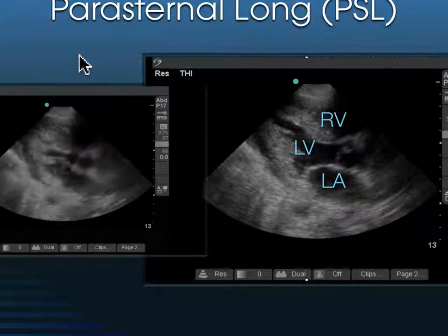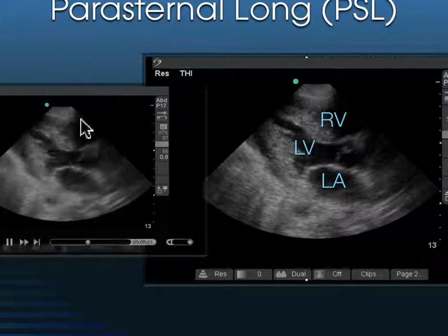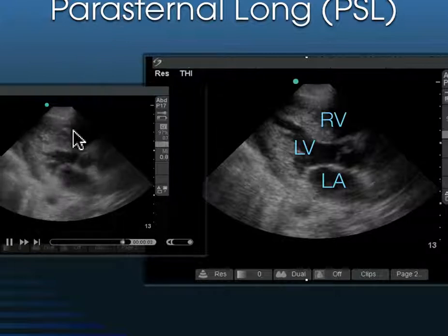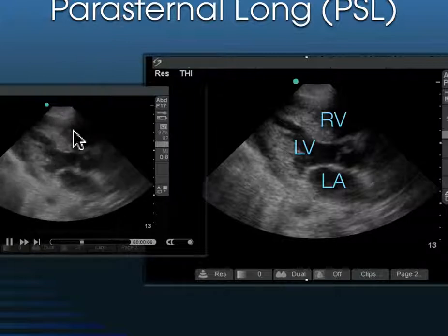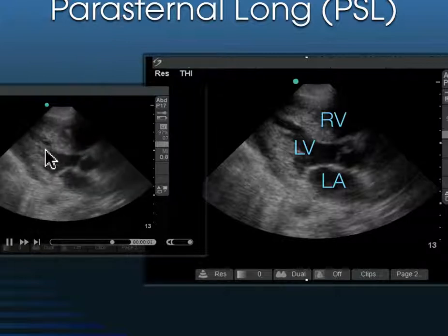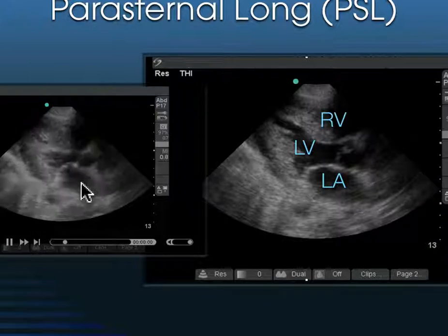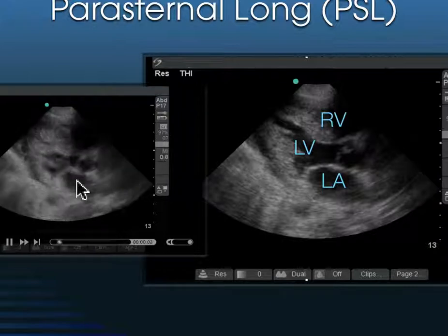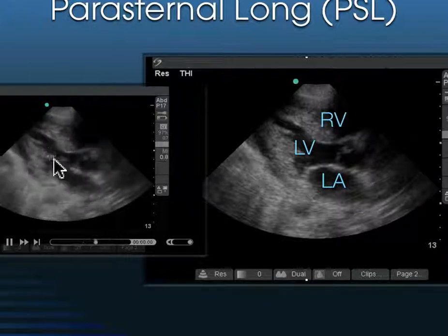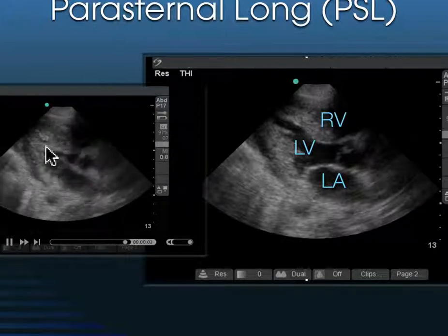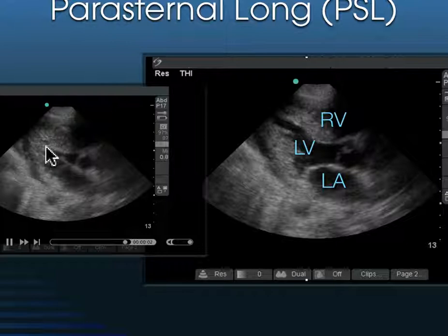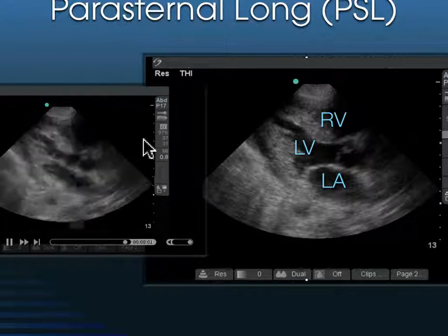This is a three-chambered view of the heart. We can see the right ventricle, the left ventricle, and here's the left atrium. Basically, the blood is going from the left atrium through the mitral valve into the left ventricle, and then out the aortic outflow tract.